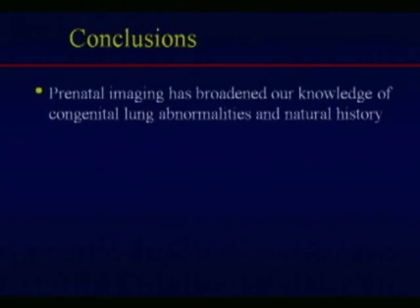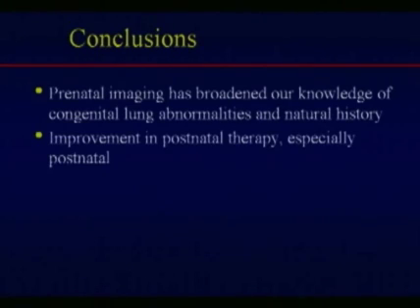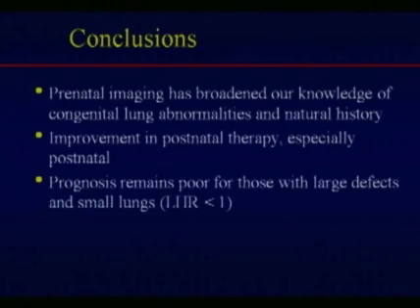Well, I'd like to conclude here. Thank you for your patience, and conclude by saying that prenatal imaging, which includes both ultrasound and MRI, has broadened our knowledge of congenital lung abnormalities and also their natural history. I believe that's improved our ability to select patients and be able to counsel patients, and that's been very helpful because there's been tremendous improvement in postnatal therapy for conditions, especially things like diaphragmatic hernia.